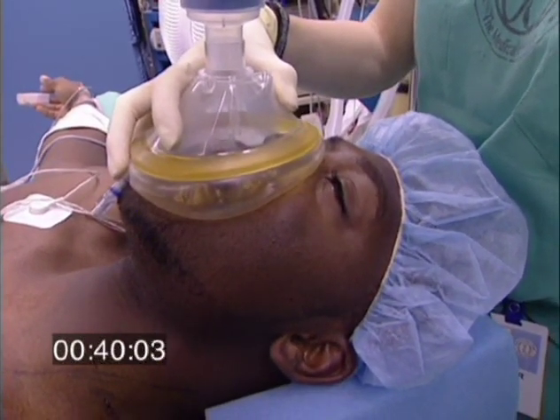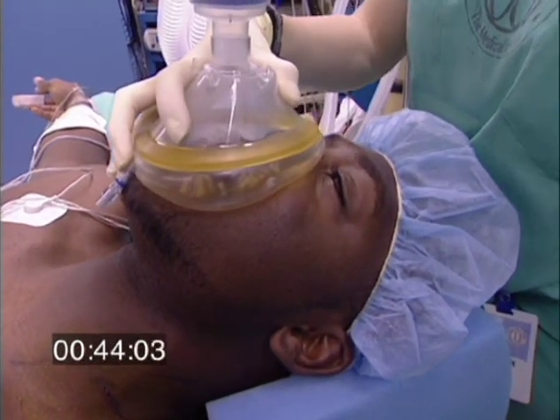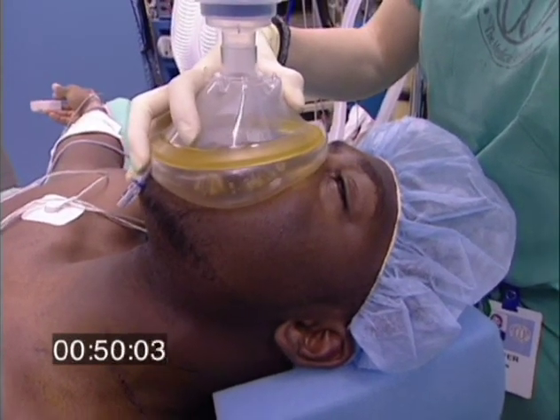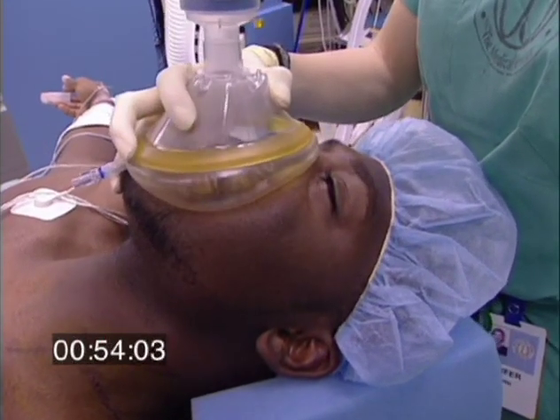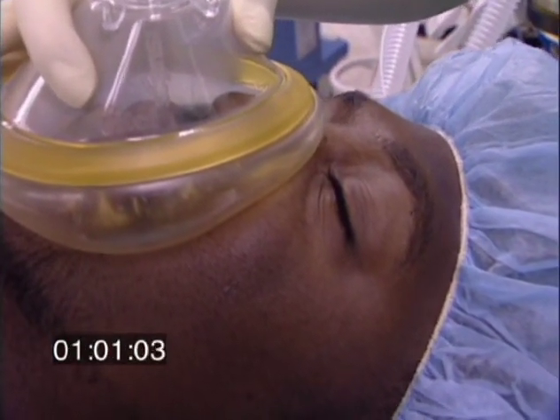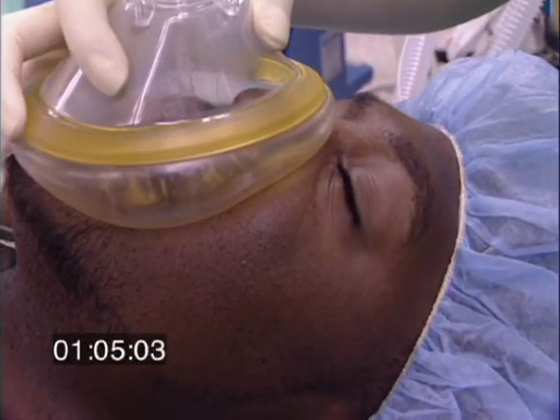Jennifer, it looks like he's beginning to get drowsy. Looks like he's still breathing. So even the 8% sevoflurane enabled him to continue breathing. His eyelids are getting heavy now. Brian, can you open your eyes for me? And then he's losing his lid reflex.